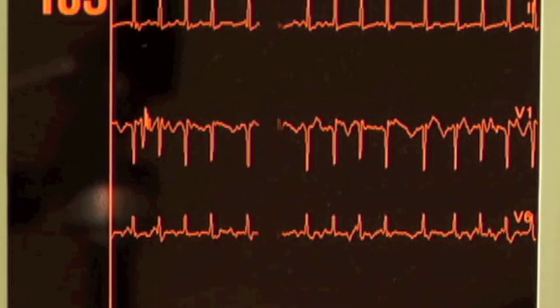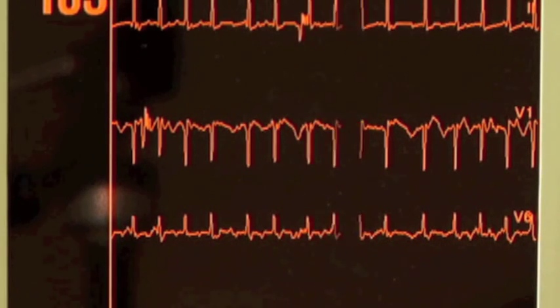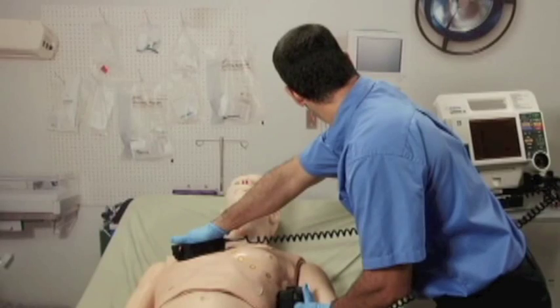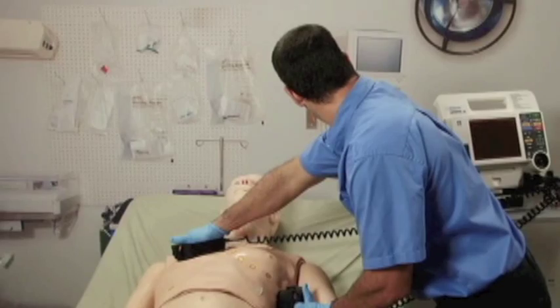analyze his cardiac rhythm, and advise action — a perfect addition to competency-based programs.